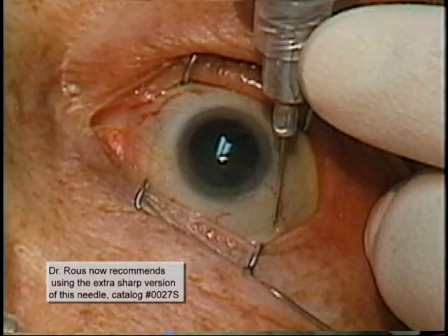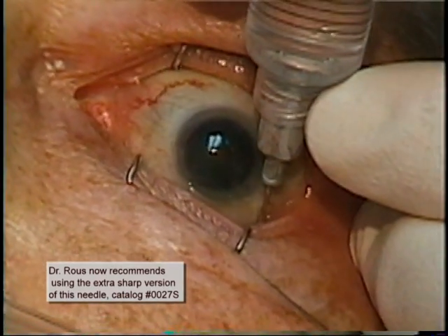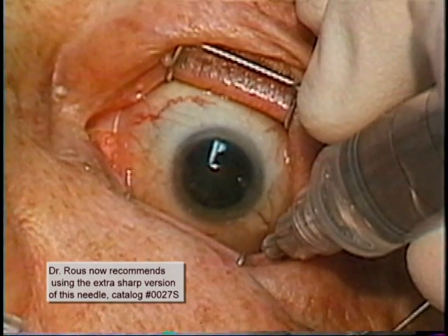In case 3, which is a left eye, again note the position of the needle tip inferotemporally, about 10 millimeters from the limbus. Notice how easily the needle passes tangentially around the globe. Because of the mildly blunted tip, the bevel placement on the inside of the curve giving a bevel-down effect, the direct visualization of the process, and the tangential passage, one should have no fear of penetration of the globe.